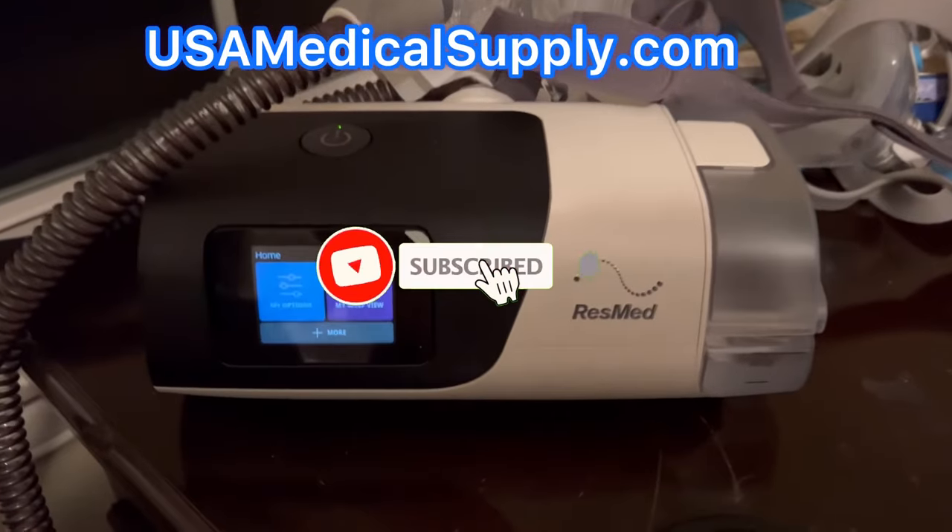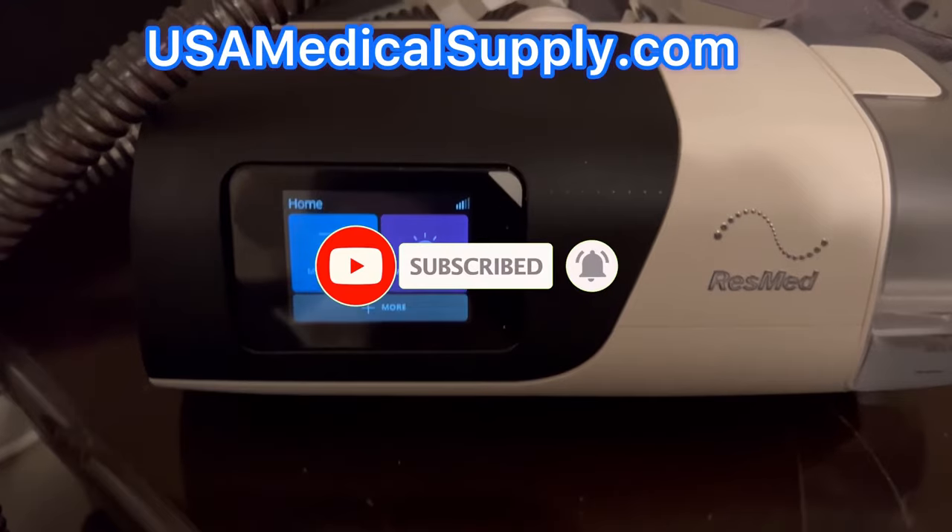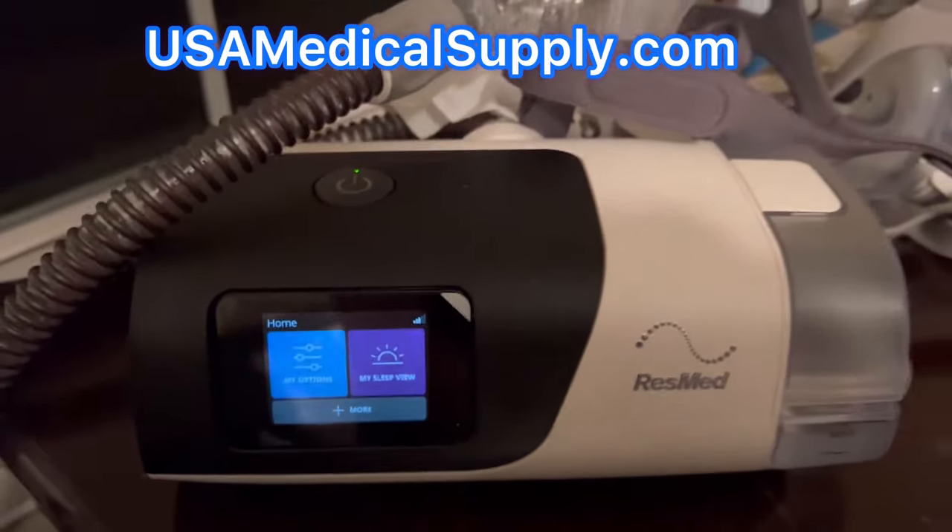What's going on everybody? I want to introduce you to MaskFit. It was on the AirSense 10 and now it's on the AirSense 11. I'm going to show you how to use it.